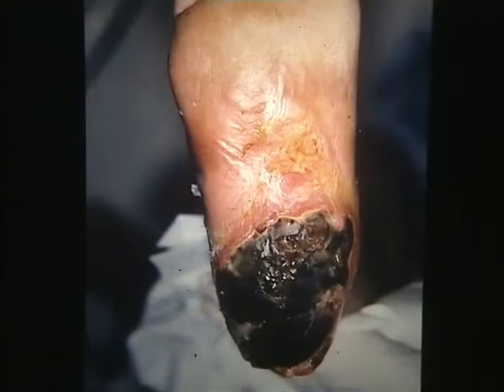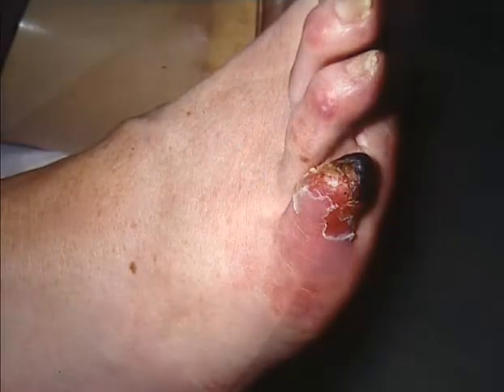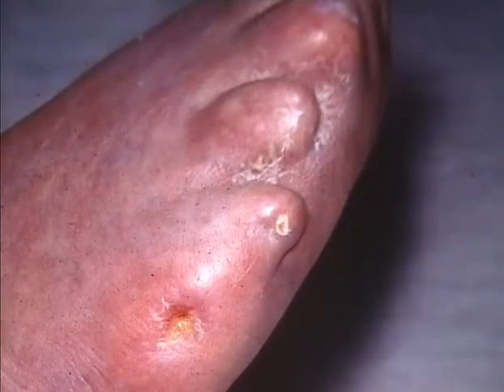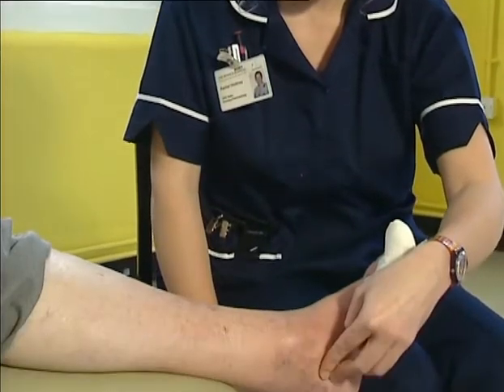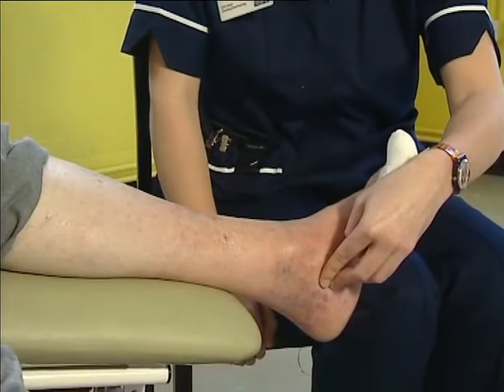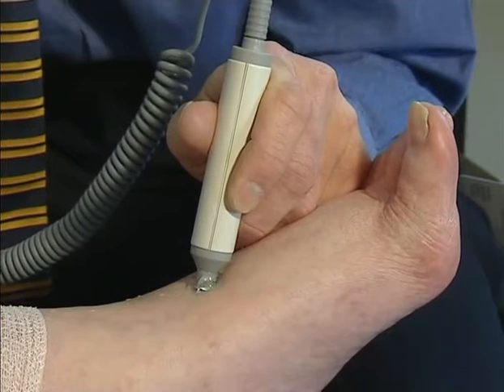Foot complications are the most common reason for admitting a patient with diabetes to hospital and are the most costly of all the diabetic problems. This video is intended to provide the essential information for those involved in assessing the diabetic foot.